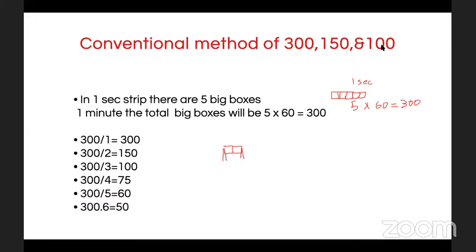طيب إذا شفنا الآر الأولى والآر الثانية، عند the second box راح نحسبها على هذه الطريقة. طيب قول 1 2، نعرف إنها صارت 150. أوكي، إذا شفنا الآر بعد only one box نقول 300 beats per minute. إذا شفنا الآر الثانية بعد 2 boxes نقول 150 beats per minute. إذا شفنا الآر الثانية بعد 3 boxes نعرف إن الريت is 100 beats per minute وso on.